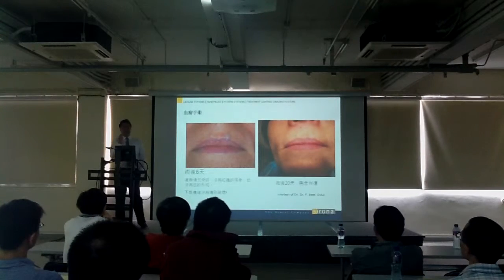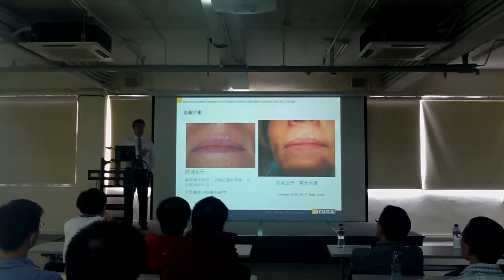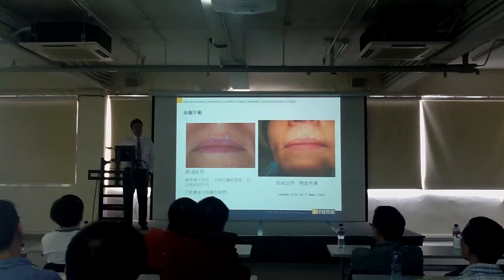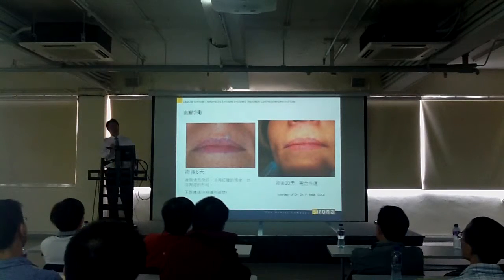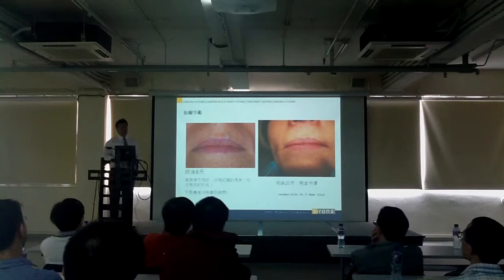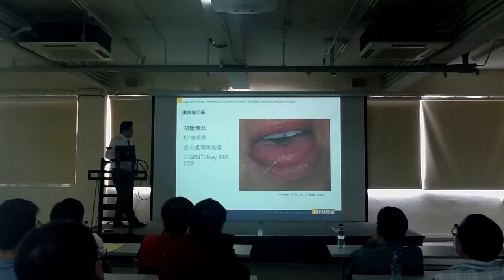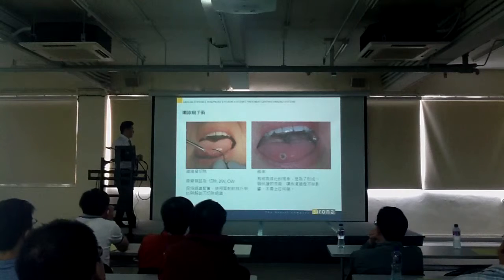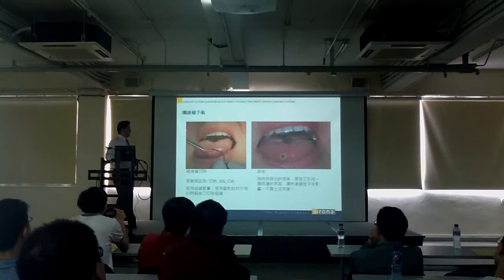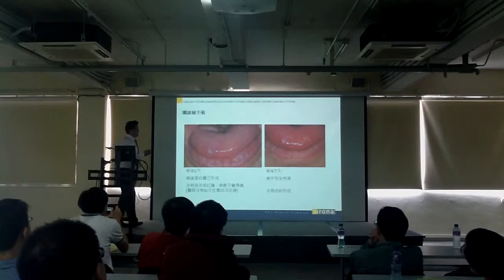Using laser, is it really that much better for a dentist? Sometimes it's not. Laser is better for the patient. The healing process is faster, it's more comfortable, and less scarring. It's for your patient. And for you, maybe you don't feel much difference compared to conventional treatment. There's a fibroma on the tip of the lip, or tongue. So the 3 watts continuous wave, you get one of those. You don't have to do anything to the wound. 2 days later, 7 days later. Back to normal.